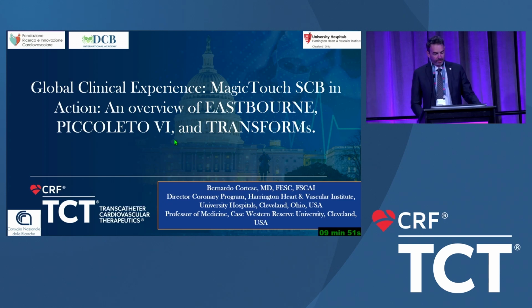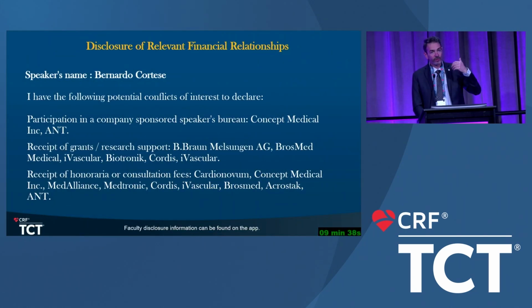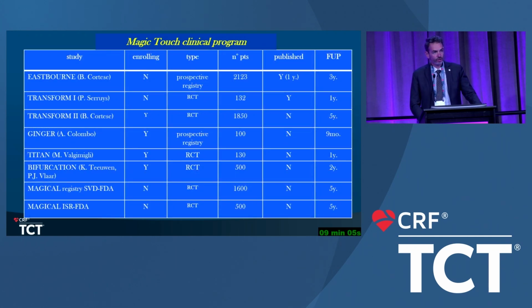So yeah, I will go through these big, actually not 3 but 4 clinical trials that have been published or are ongoing on this novel technology that we have, and that was the first one which came into the market for DCB after paclitaxel. So we have a number of paclitaxel. Now we have 3 Sirolimus Coated Balloons in Europe, but as Azeem said, in the US, we only have 1 paclitaxel with other devices that are approaching. So the clinical program of this device started with the simple lesions, small studies with angiographic follow-up, and then went through a more complex lesion and patient setting.